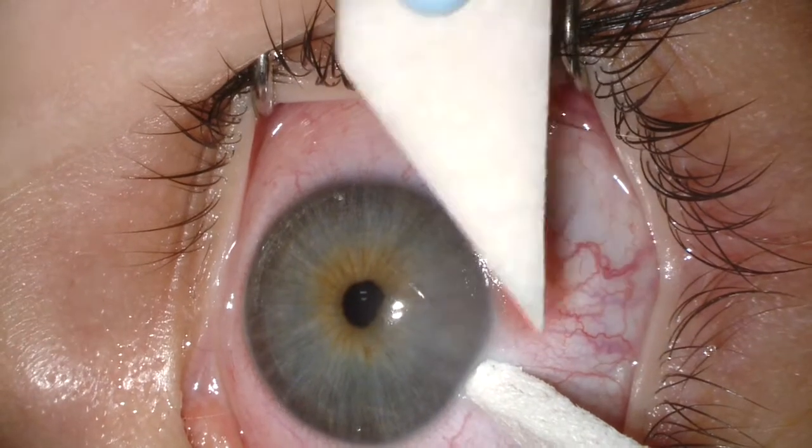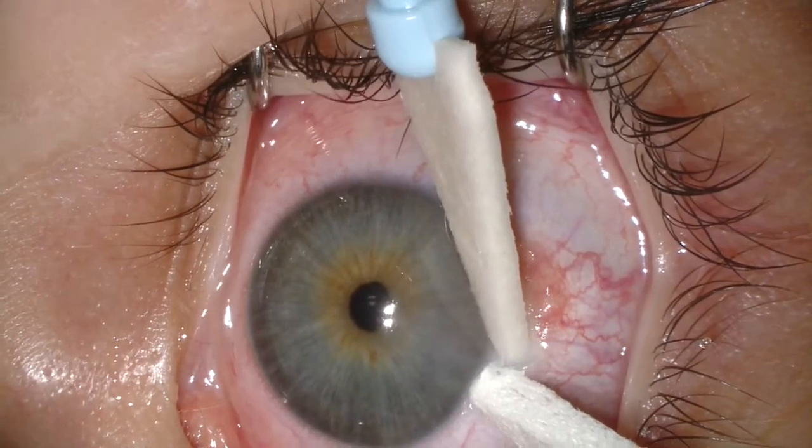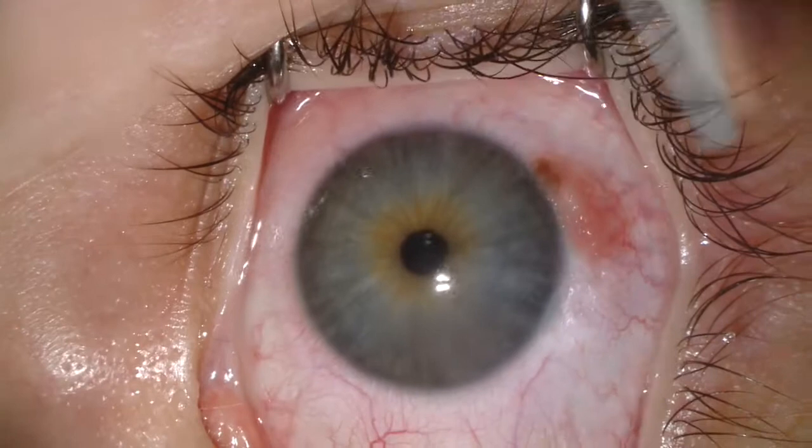The first step is a drying maneuver where we dry the corneal epithelium immediately adjacent to the nevus and apply absolute alcohol.